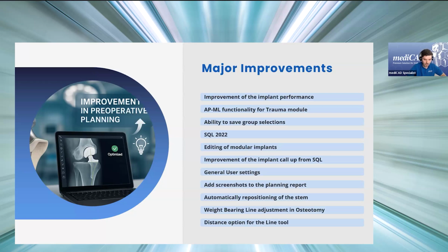So yeah, highlighting a few of those points, I will start with the technical stuff to get it out of the way, since not everybody here is probably interested in that. For this we implemented the implant database with SQL 2022. If anybody in IT is listening, this is also in terms of the installation pretty simple. If you already have a current version with another SQL version, you can just skip the SQL installation and just install your PV update straight away.